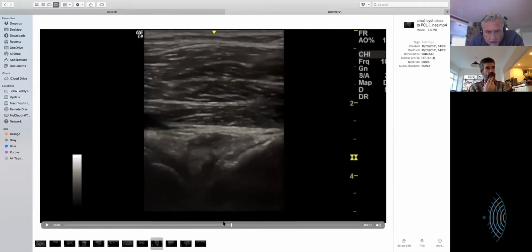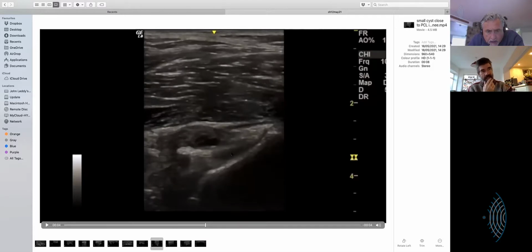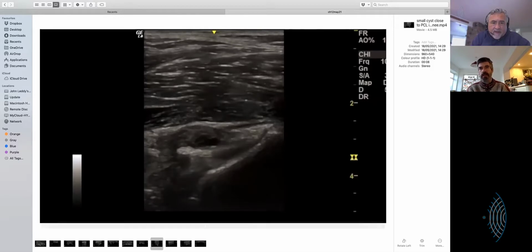There. Okay. So I scan this routinely when I scan a knee. I need to know how to do that. You know how to scan the medial joint line, yeah? Yes. So you scan the medial joint line. Most people stop when they run up against the hamstring. Yeah, the posterior horn, as best you can. But what I do is I roll the patient onto their front. I get them to relax their leg, and sometimes I hook my arm under their shin, tibia, to make it soft.